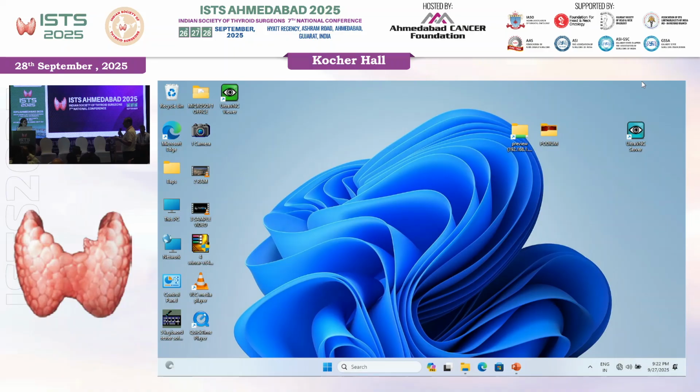The second thing is where the nodule is in the thyroid. A well-centered nodule in the thyroid, you will like to observe. Surgeons and the new guidelines which are coming for the surgical management of thyroid also say that those are the nodules which are safe to observe.